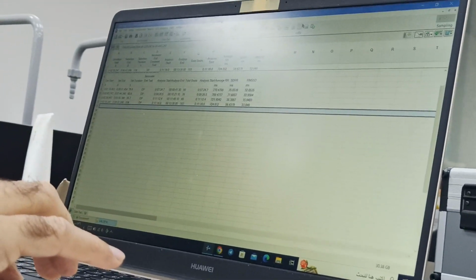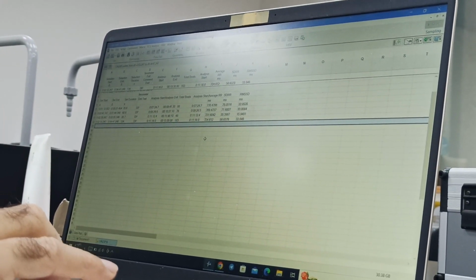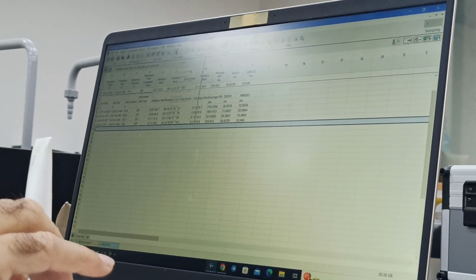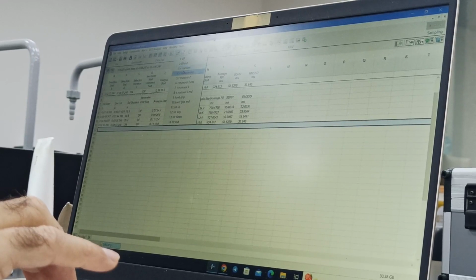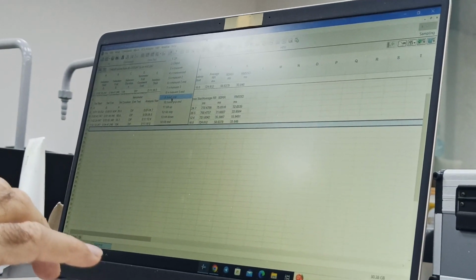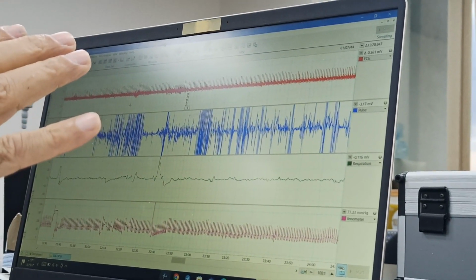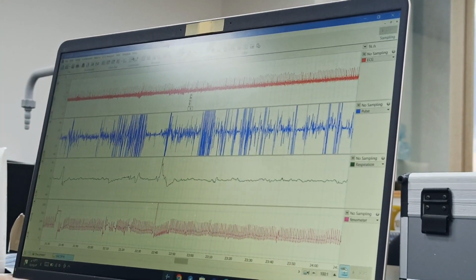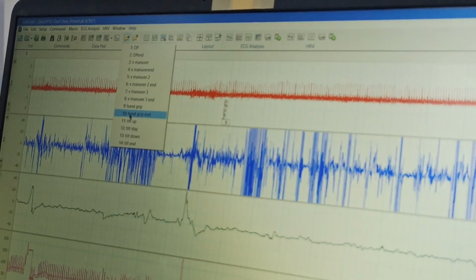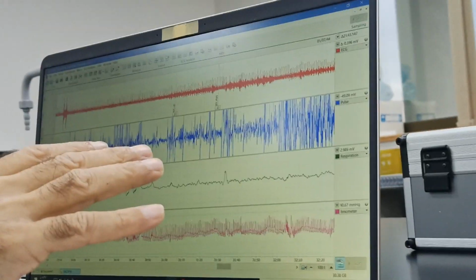All right. So this is how you are going to record for the whole. Now you could go to any segment by pressing onto the comment. So for example, now hand grip, if I just press, I am on the record of hand grip. I go to the comment section, select, say, tilt up. Okay. So now I am on tilt up.